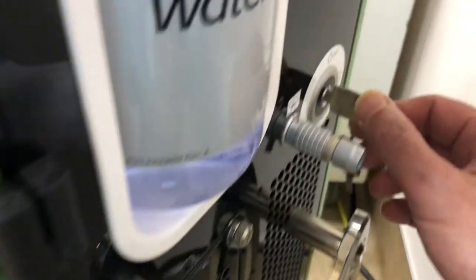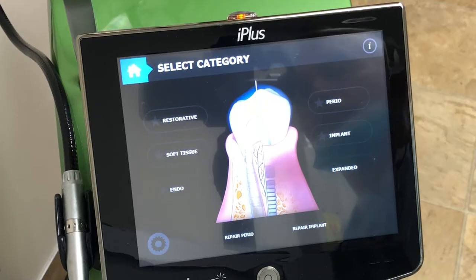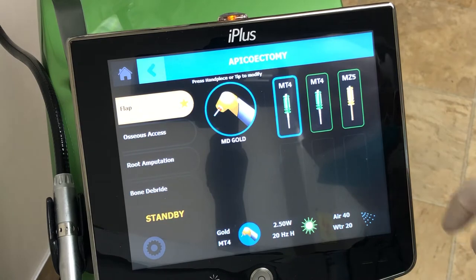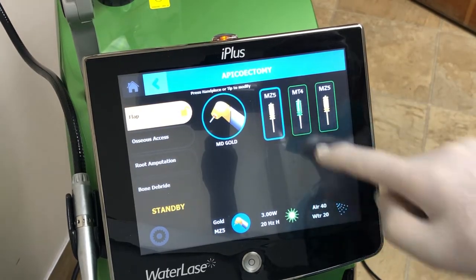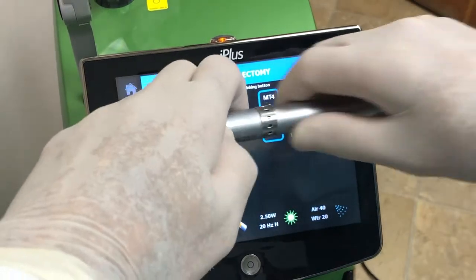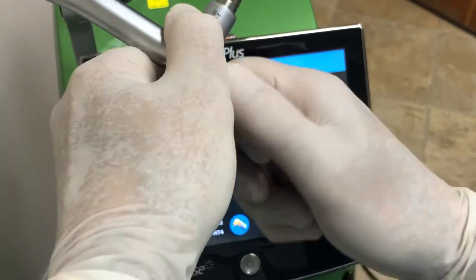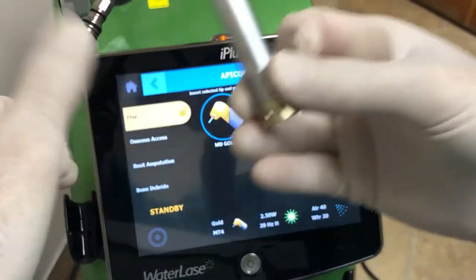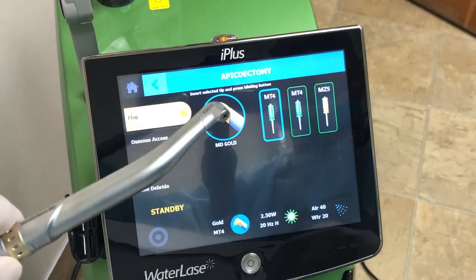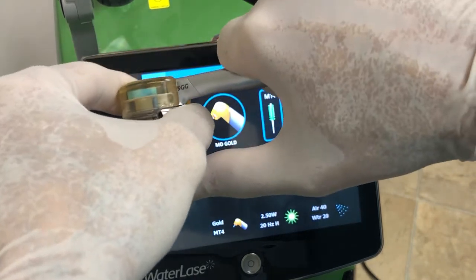For almost every step of the surgery I will be using the I-plus Waterlase by Biolase. Here I'm showing you step-by-step setup procedures, and we will start with the flap procedure. The Waterlase I-plus has preset programs which give you the correct choices for tips and preset frequencies and power outputs. These settings can be adjusted very easily depending on what power and tissue effect we desire. It is essential to wear loops to get visual feedback as to the effect of the laser on the target tissue.